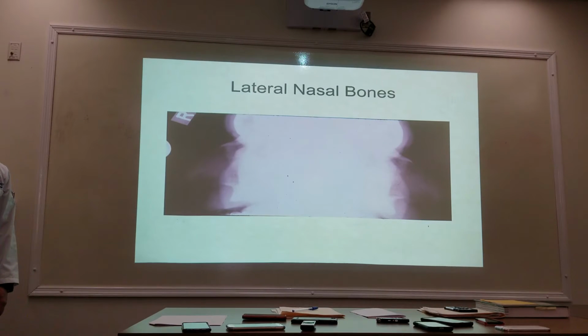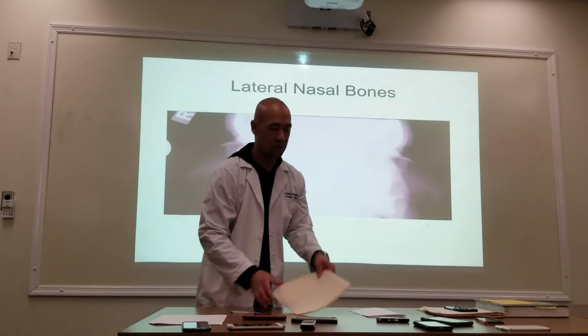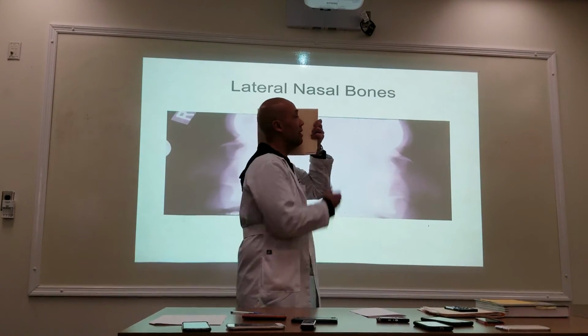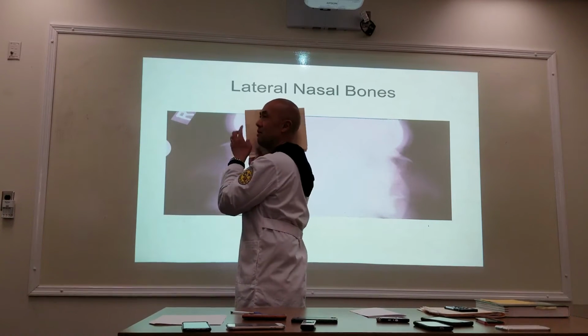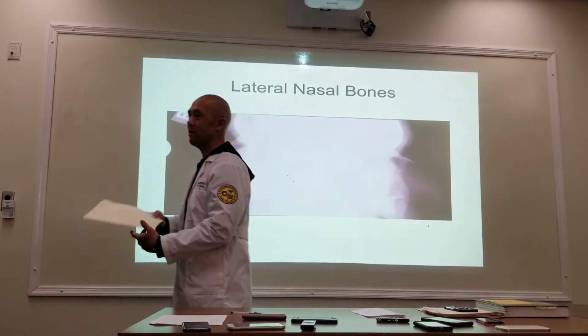Okay, and then here's another bilateral. Wait, they shot it on the same, was it film, and they shot it on the same cassette? Oh. So on the same, so we would do, for instance, here's my left, and there's my right. So we can actually do two images on one cassette. That's the way we used to do it.